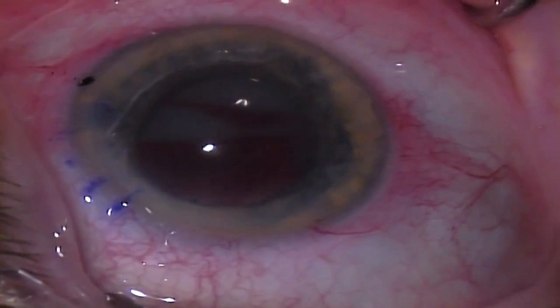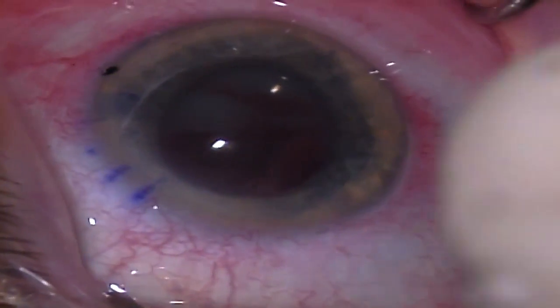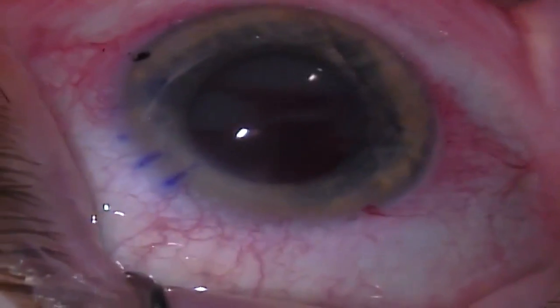I have used many pupil expanders in the past and prefer the eye ring because it is gentler and faster than other pupil expanders I have tried in the past.